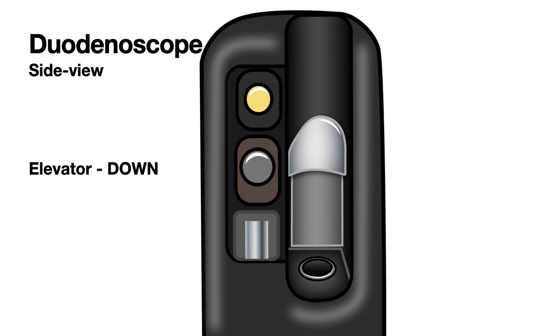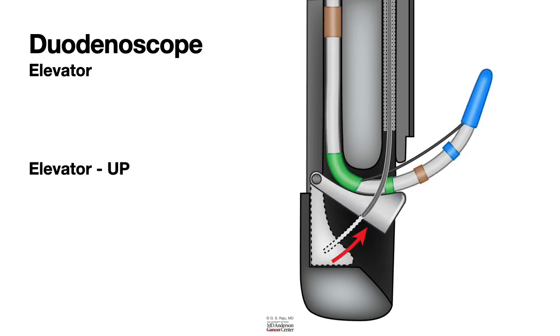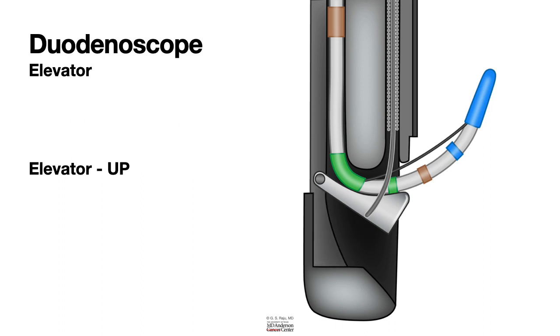Let us look at a side sectional view of the duodenoscope to look at how the elevator functions. There is a wire that moves the elevator from down to up, that allows the sphincterotome to look up, that allows the cannulation of the bile duct and the pancreatic duct. So we've learned about different aspects when it comes to ERCP.